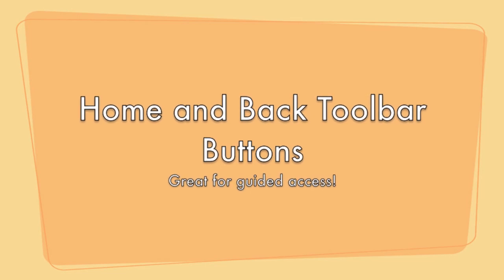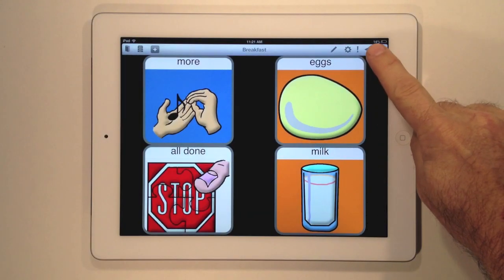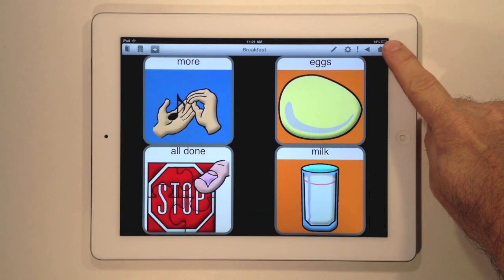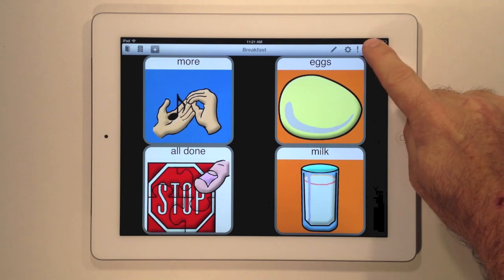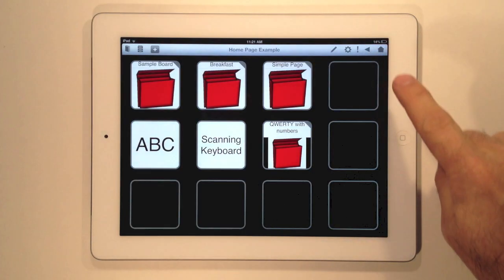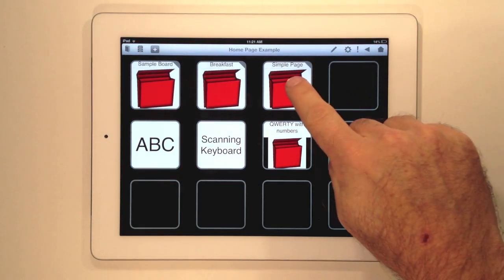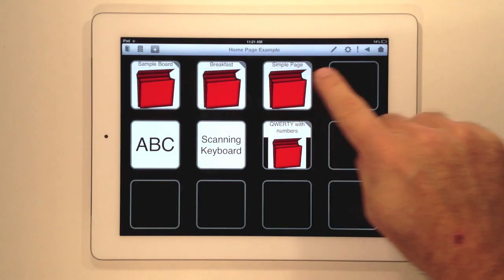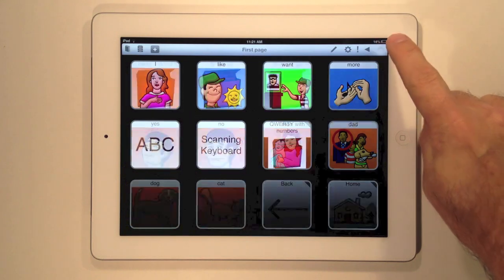For those of you that use Tapspeak Choice mainly for communication boards with assisted navigation, we've added a back and a home button to the toolbar that makes it easier for you to navigate around the app.